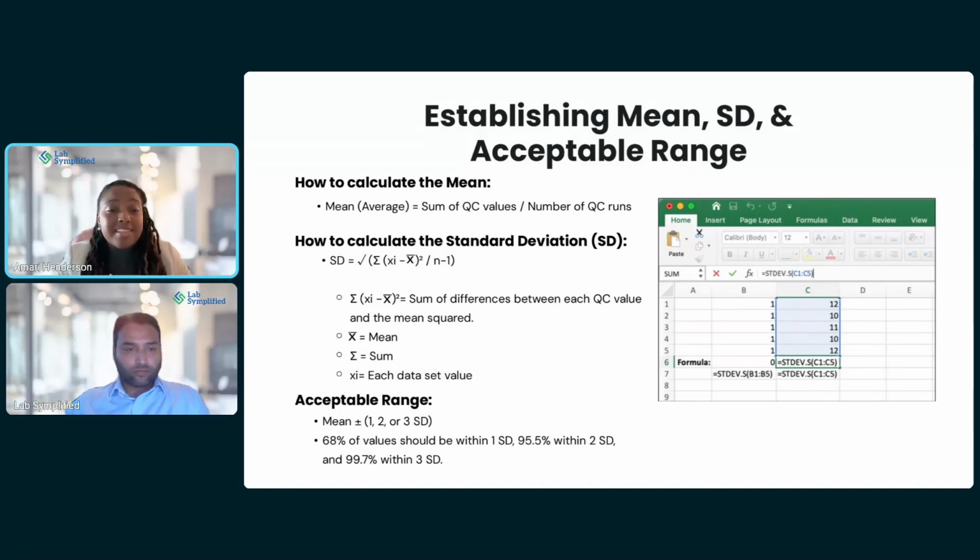I have had situations where I wish I would have acted differently. I did have a situation where I couldn't get QC in the whole shift. And instead of speaking up and talking to someone about what was going on, I was a little ashamed that I couldn't get the QC in, so I didn't speak up until the end of the shift. And so we did have to go back and pull patient samples just to rerun those after we got the QC in, just to make sure everything matched as far as patient samples. So in that type of event, maybe you want to reach out to someone that has a little more experience to try to pinpoint what's going on, because that's definitely an extensive period of time to have QC out for so long.